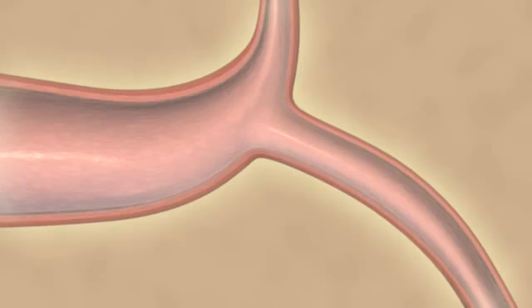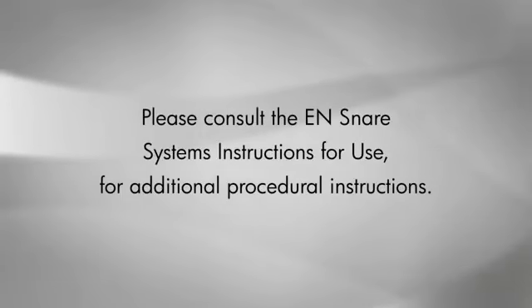Withdrawal of foreign bodies may require the insertion of larger sheaths, guiding catheters, or a cut-down at the peripheral site. Please consult the Snare system's instructions for use for additional procedural instructions.